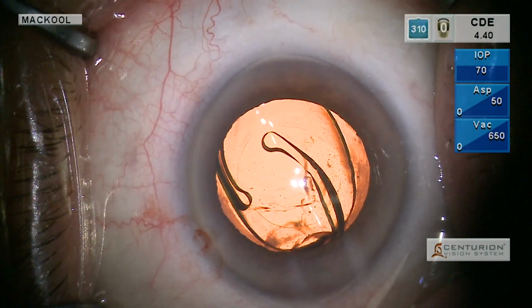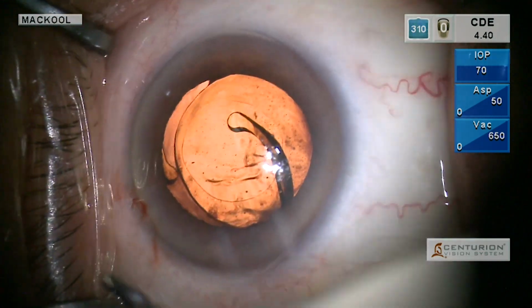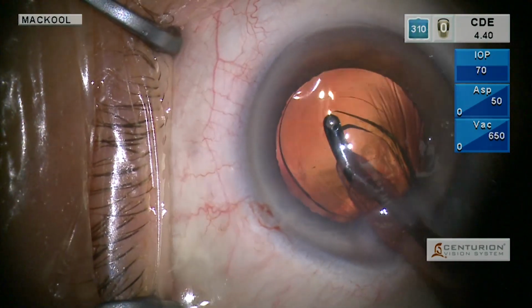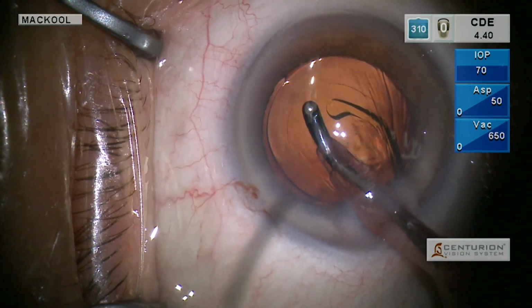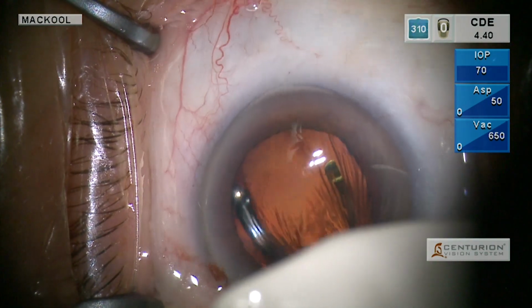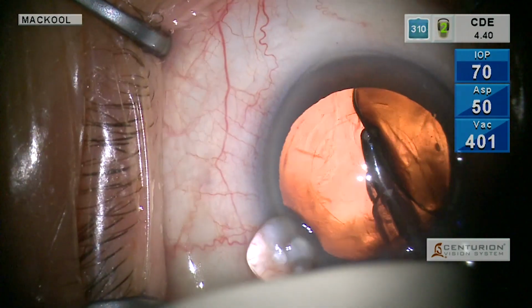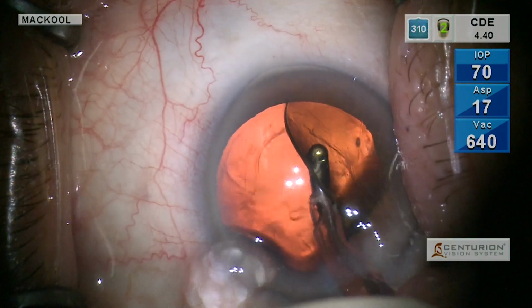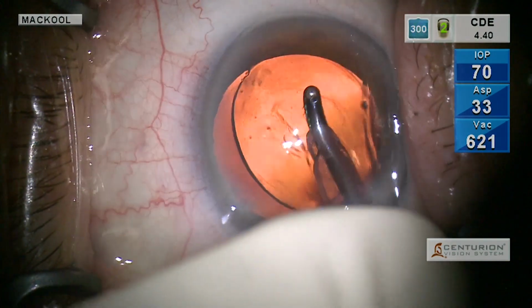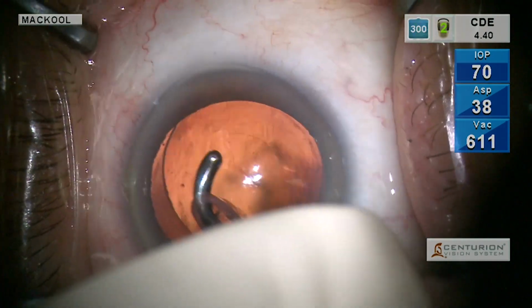So there's our single piece acrylic lens injected into the capsular sac. And now it remains only for us to remove OVD. And I'm going to do it first from behind the optic and just nudge it to the side and slip the curved 90-degree I/A tip under it. So now we've removed OVD from behind and now in front of the IOL.